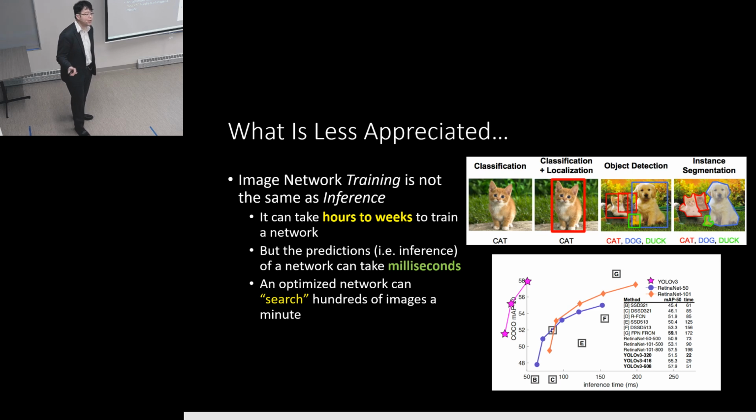But once you have trained and configured a network, the other term, which is inference, which means the prediction of where is the cat pointed out, where is the cavitary lesion on that chest X-ray pointed out, right? These things take milliseconds. Okay, so some of the scores over here, per localization event, you're talking about milliseconds between about 50 to about 172 milliseconds.